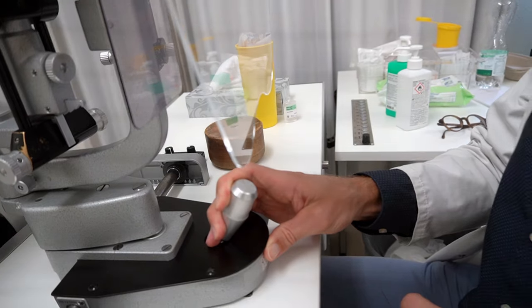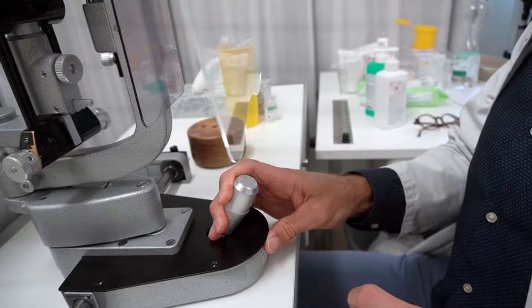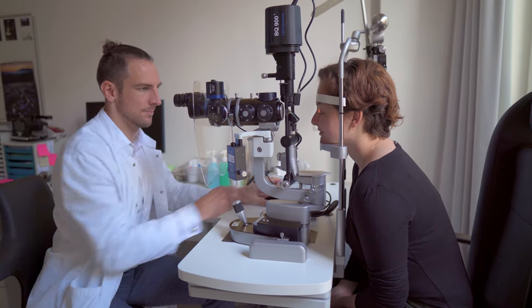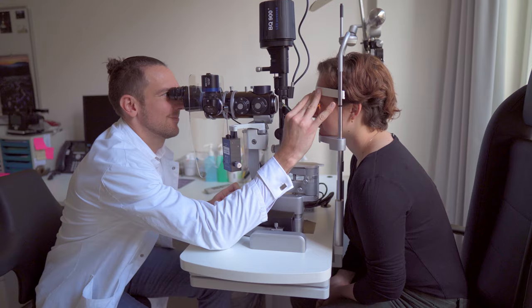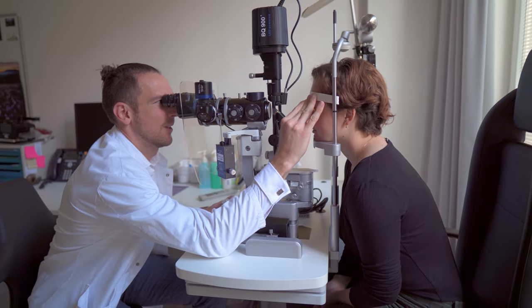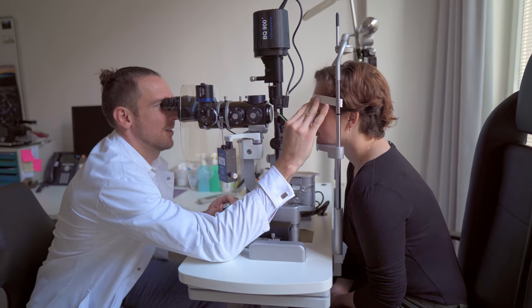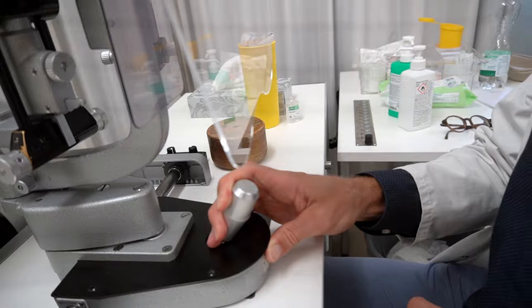Center the light beam in the middle of the pupil and pull back the slit lamp in a straight line. Now most experienced examinators will put the lens in front of the eye and then pull the slit lamp directly into focus. This can be super confusing for beginners so I recommend this: Pull the slit lamp all the way back and put your lens between the slit lamp and the patient's eye. Now you can see the whole eye upside down.